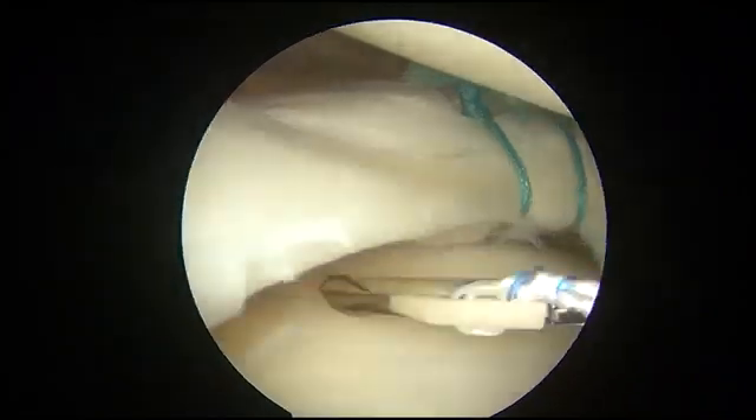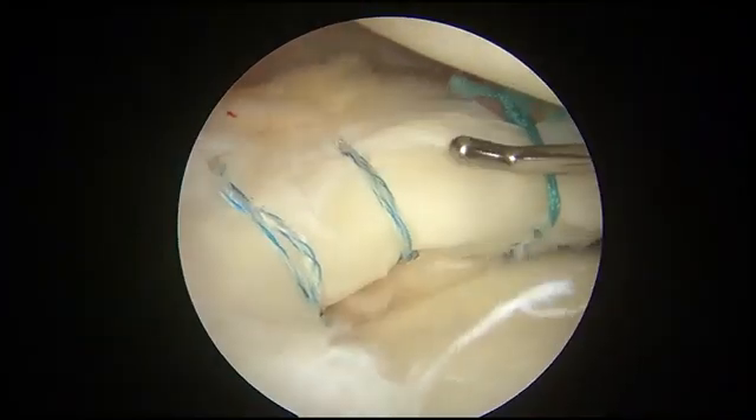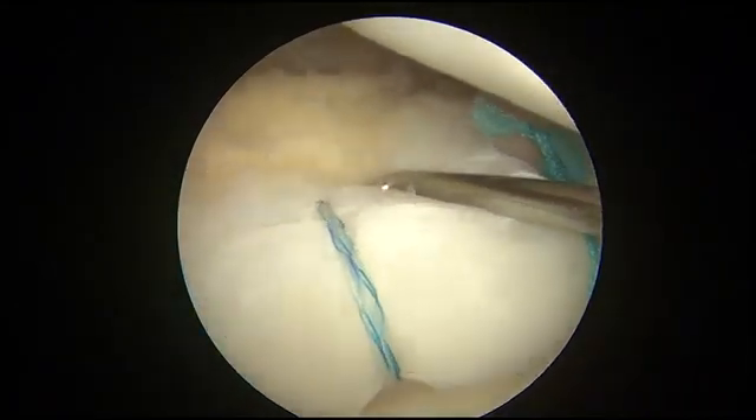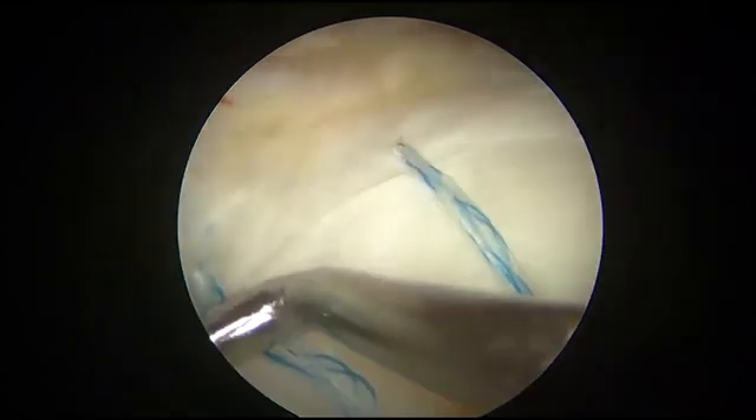Mobility of the meniscus is checked after repair. In this case, two stitches were conducted by the described technique and two stitches were sutured by all-inside meniscus repair devices.